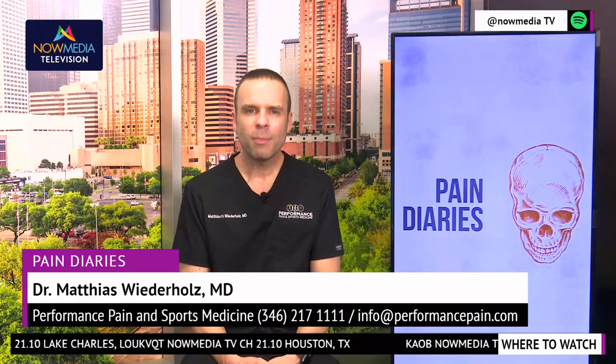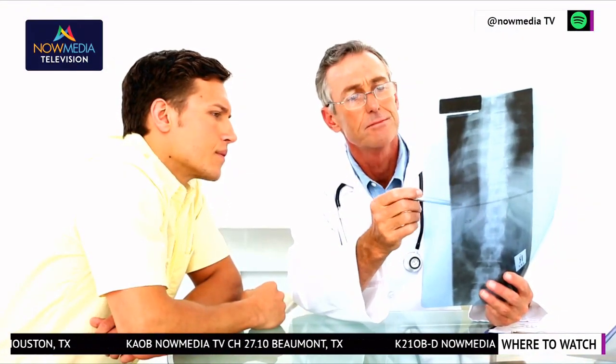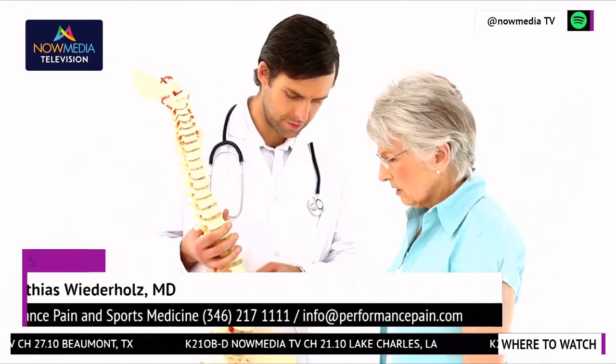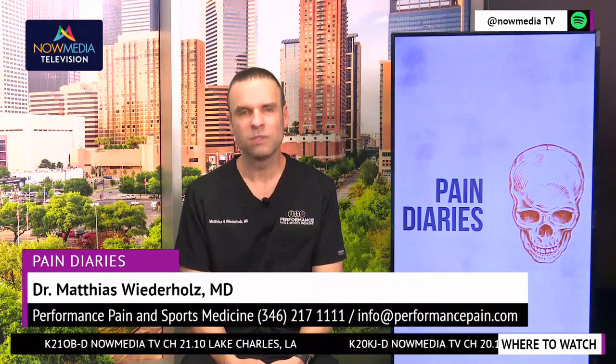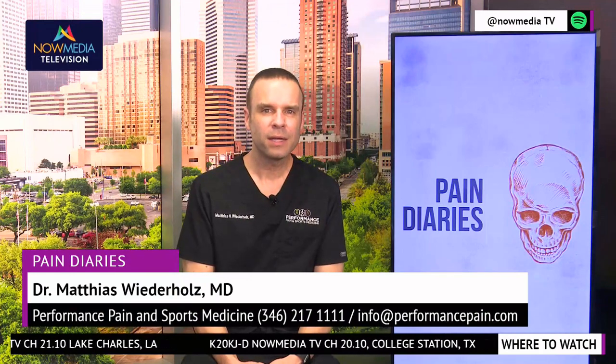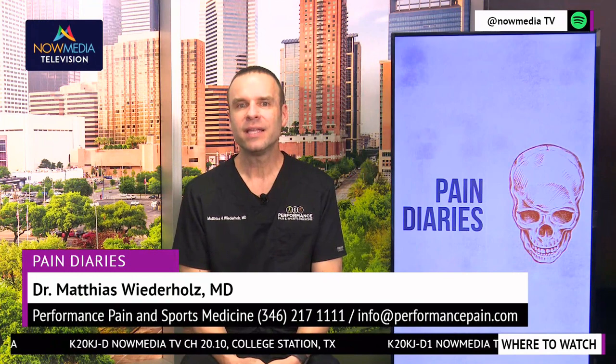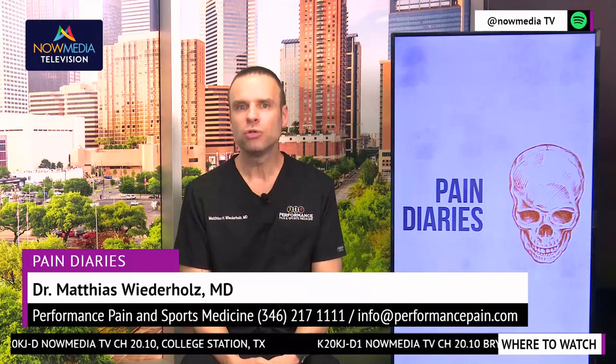Now, with diabetic neuropathy, you do have to be aware that that is a progressive neurologic disease. Your diabetes isn't cured with a spinal cord stimulator. That disease, as it progresses, the neuropathy tends to progress as well. The results out at 5 years, about 55% success. Still very good success out at 5 years. Most of those patients still extremely happy. And those patients with diabetic neuropathy are 17 times more likely to get pain relief than conventional treatment alone.